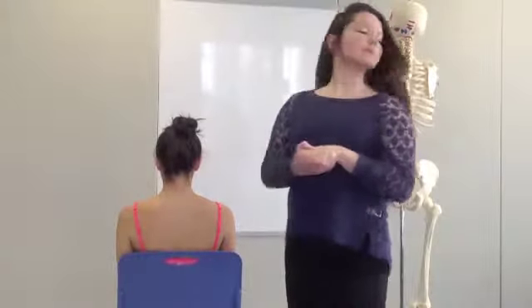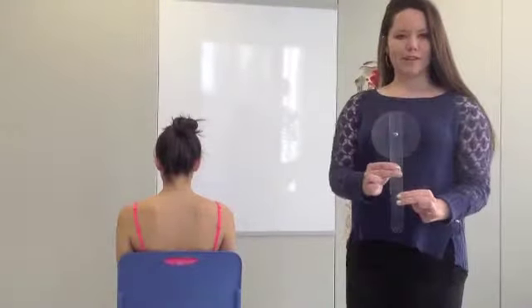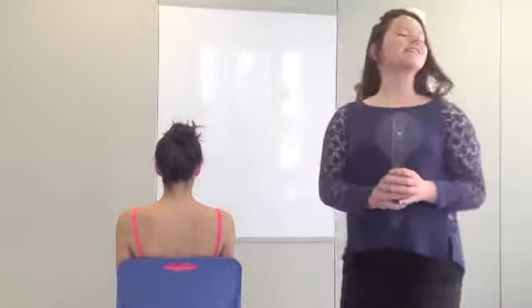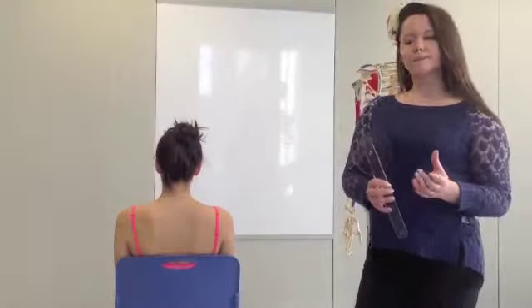As far as this test, we'll be using a universal goniometer. So this is a large universal goniometer right here. For this specific test, looking at cervical side bending, the reliability of this measurement is fairly high to moderate, with intra-rater reliability ranging from 0.7 to 0.8 approximately, and inter-rater reliability ranging from 0.6 to 0.75 approximately. So overall, the reliability of these measures are moderate to high, with the validity not being reported on.